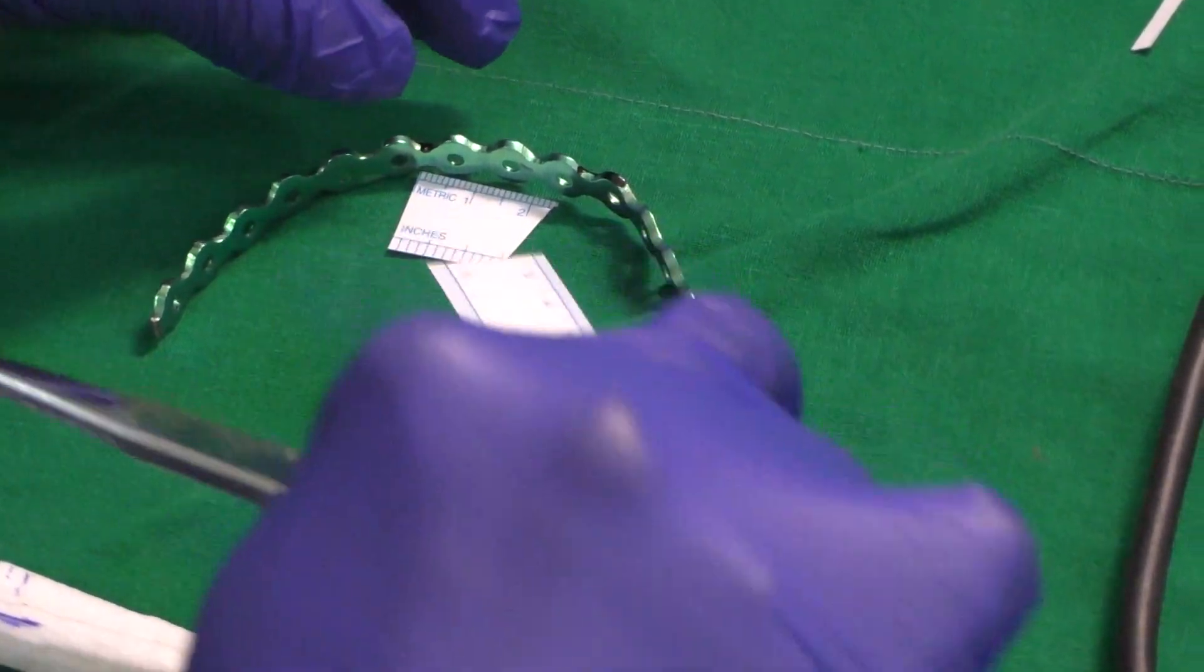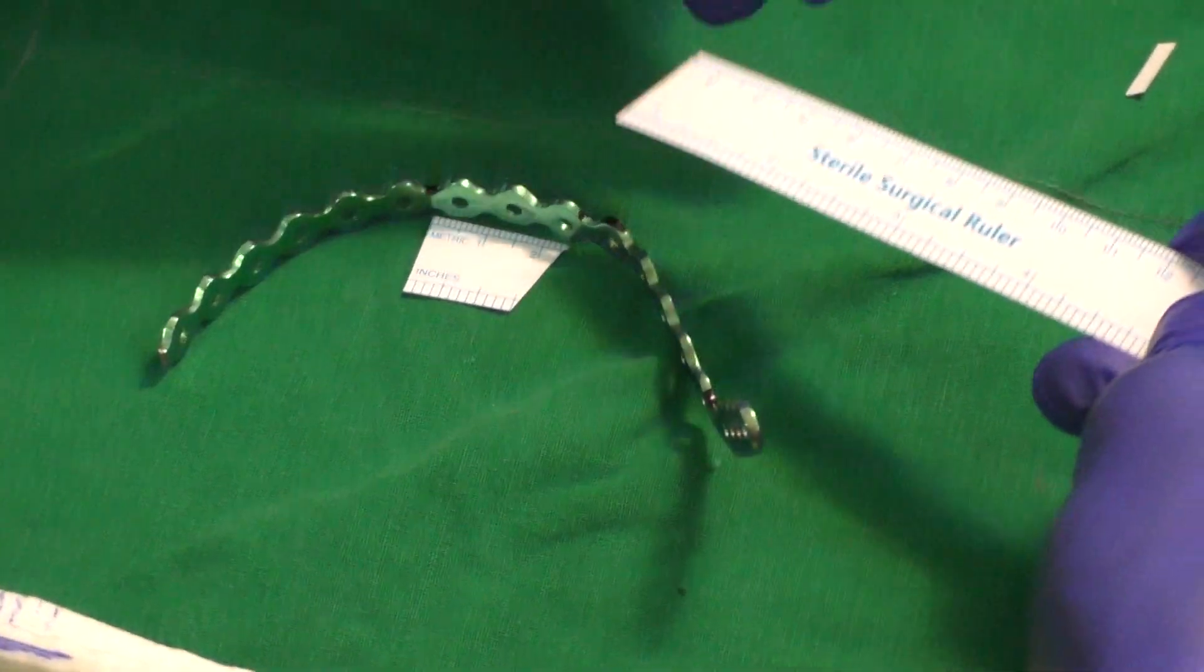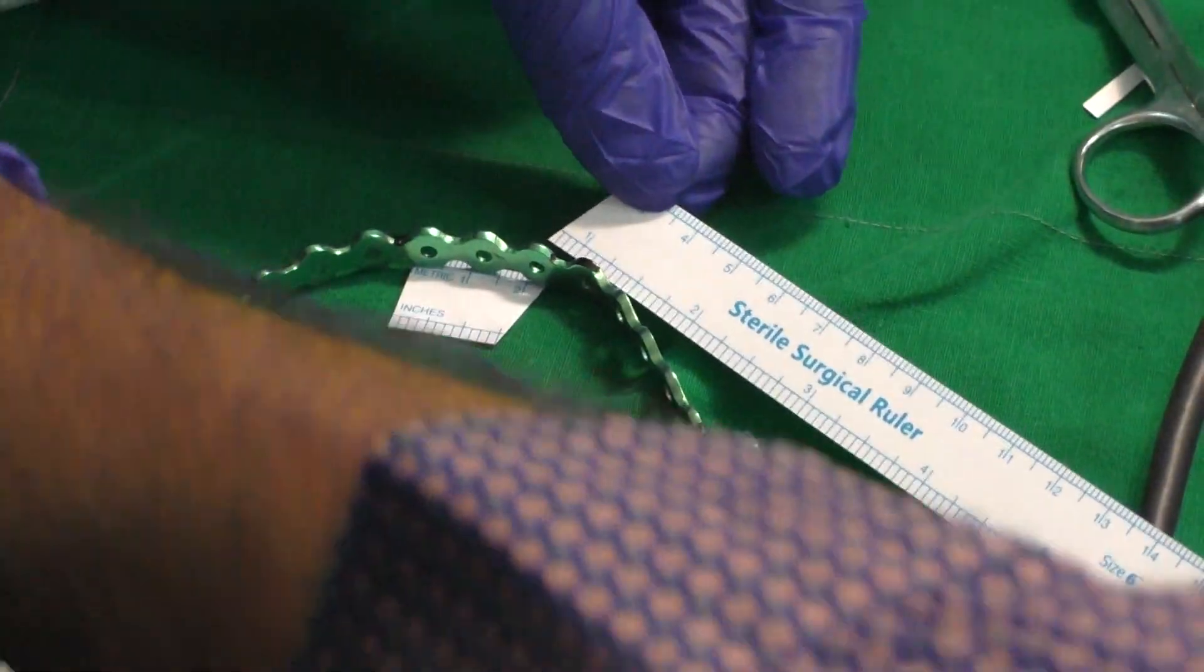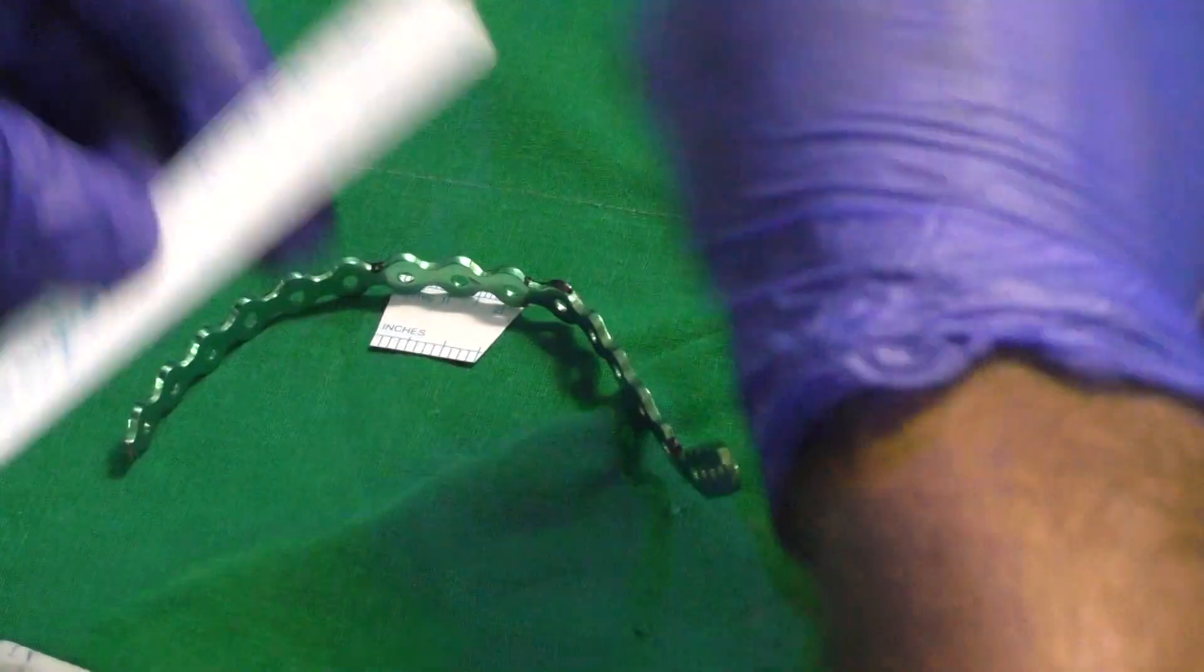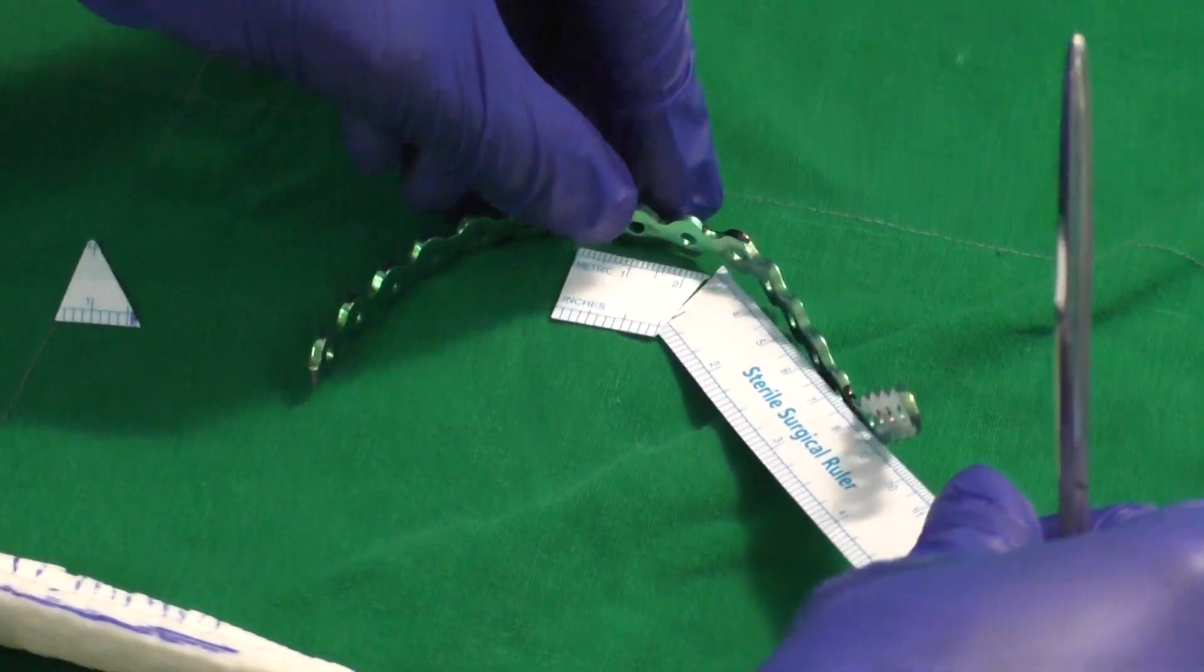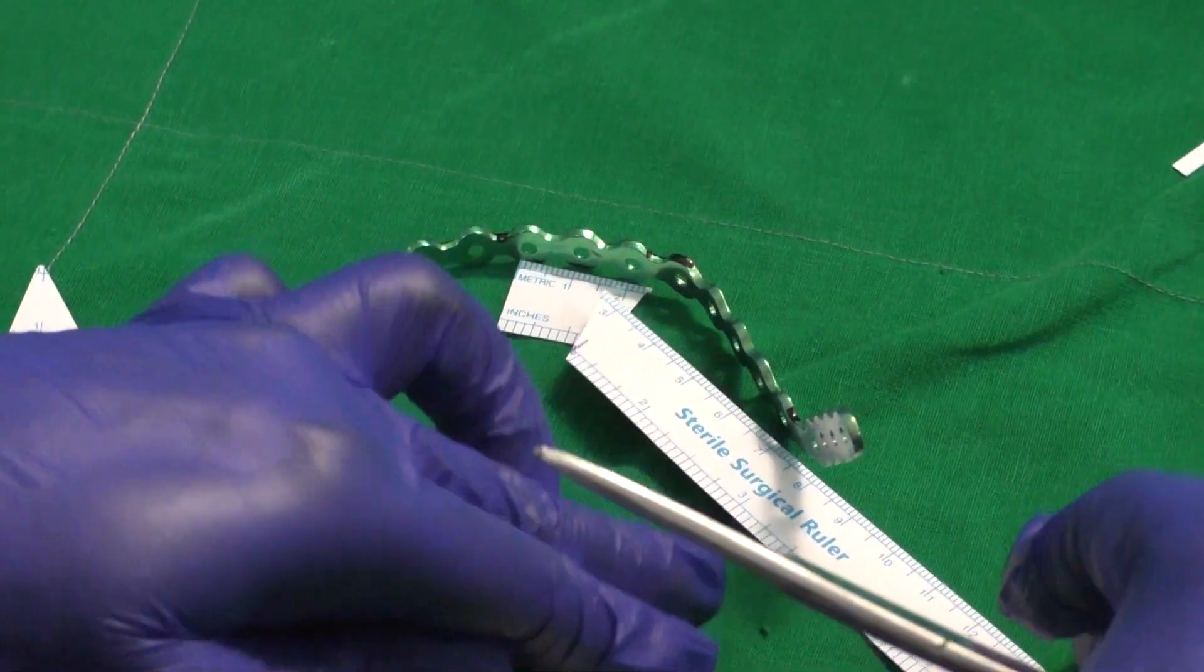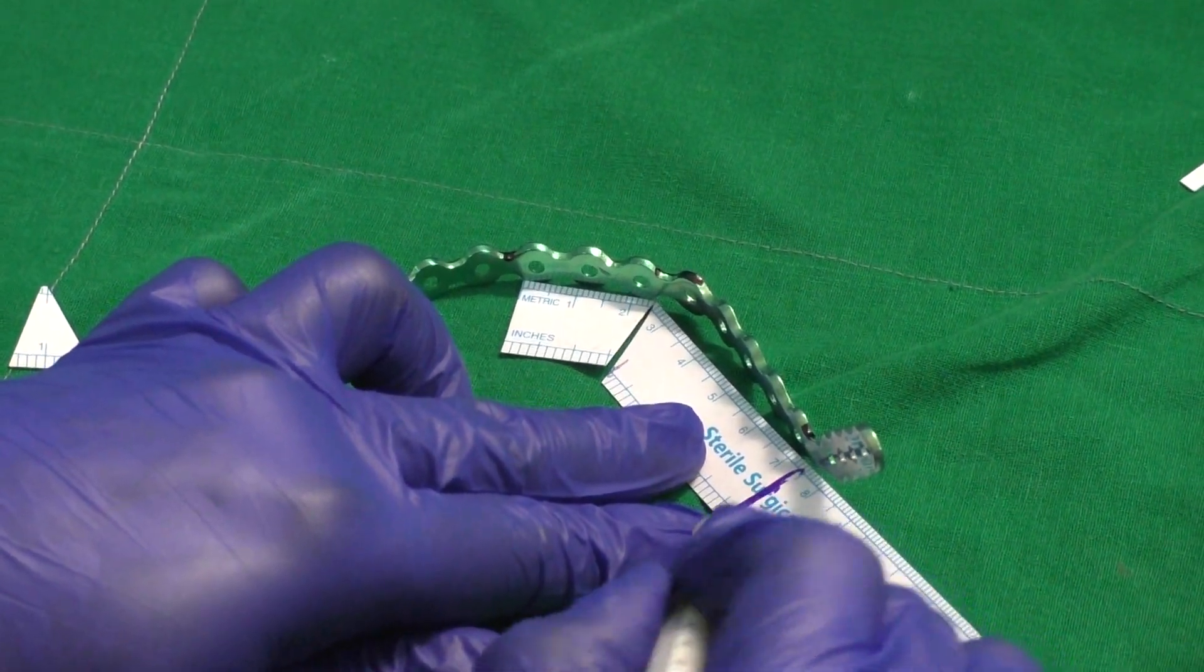Now this denotes the proximal segment. Now the same paper scale is used once again and the base of the osteotomy that is required is measured across the circular mark that was made on the outside, and this was again about a centimeter. Now using the scissors the base is cut away, and then the paper scale is placed close to the first segment to see for fit. If the fit is not correct, the edges can be trimmed till the edges of the paper bits come into good contact.